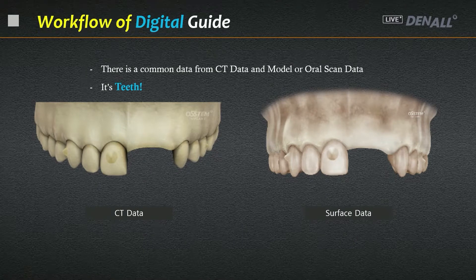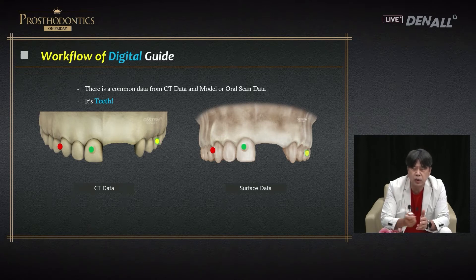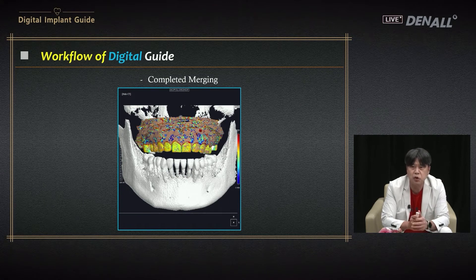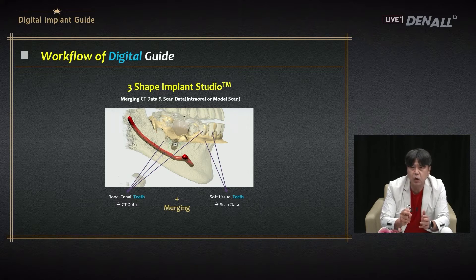On the actual software, CT data on the left and surface data are marked at the same point — for example, on the canine — and they can be merged. Surface data and CT data are merged to provide complete data including bone and gingiva. Once merged, a crown can be designed in advance. Based on that crown, implant size, depth, and position can be determined.